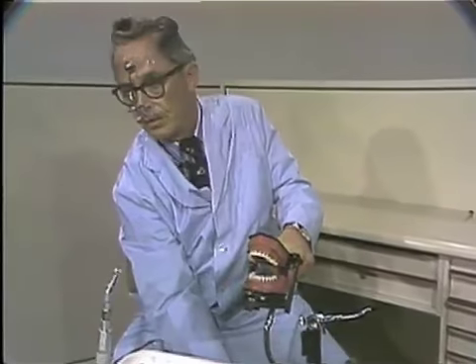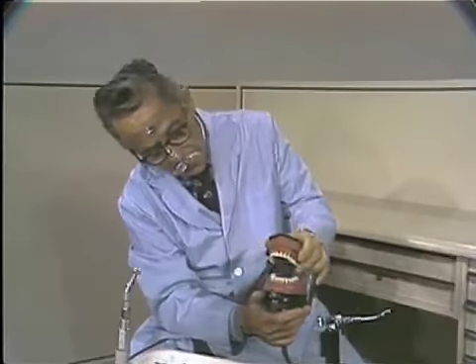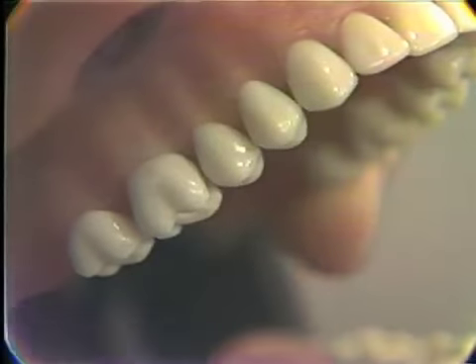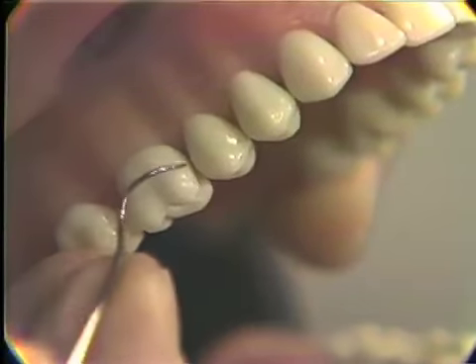I'll put the patient back again into a position that we can see from the occlusal, and we'll look again now from the buccal really, and I would like a tight shot here, I think, just to come in and show this. If we look here, you can see that from cervical to occlusal there is a slight taper, but very slight.